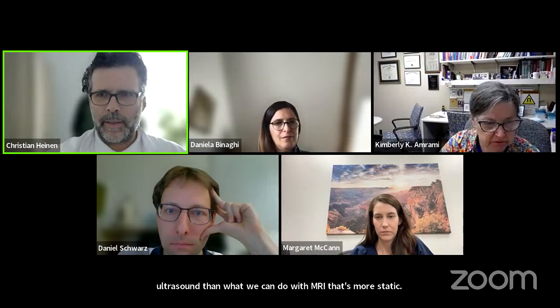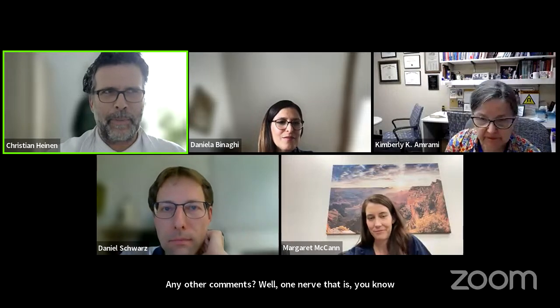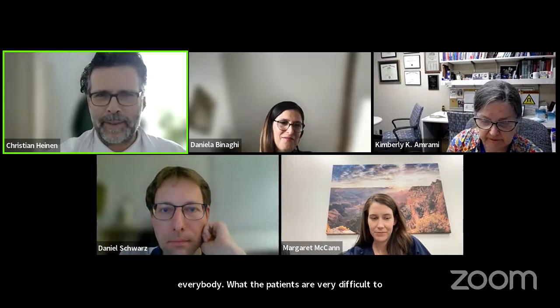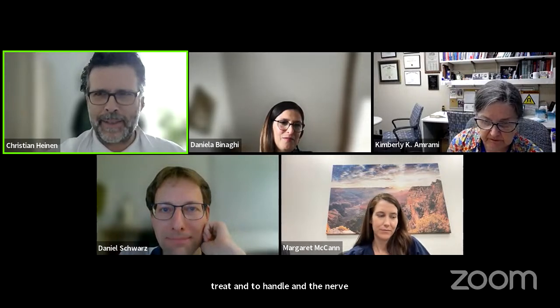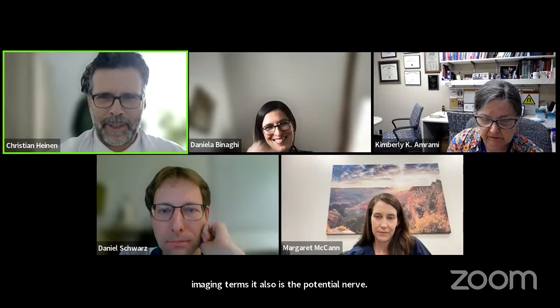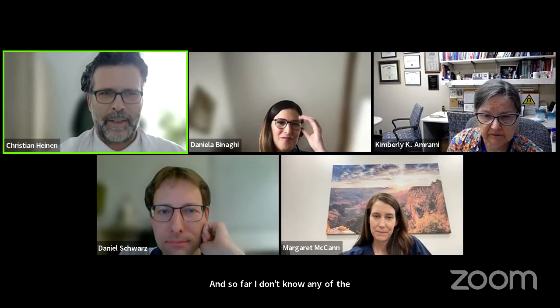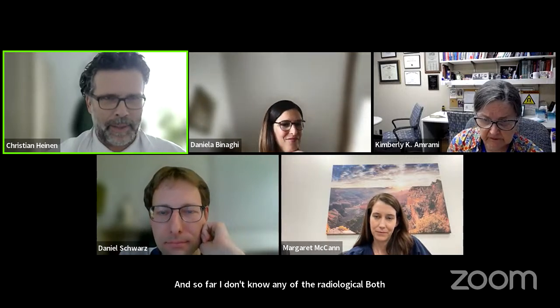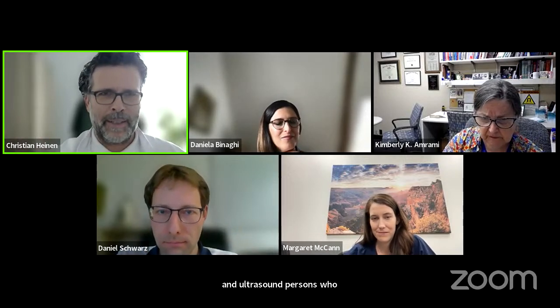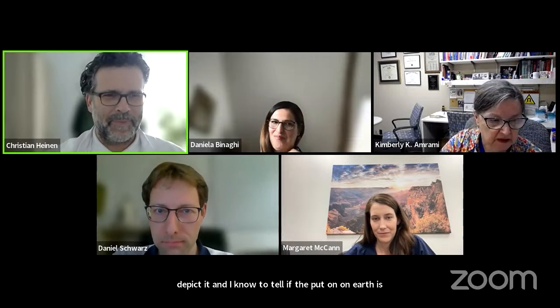Okay. Any other comments? Well, one nerve where the patients are very difficult to treat and to handle, and the nerve itself, at least in imaging terms, is the pudendal nerve. And so far, I don't know any of the radiological persons, both MR and ultrasound, who say, okay, I know how to depict it, and I know how to tell if the pudendal nerve is affected or not. What's your opinion on that?